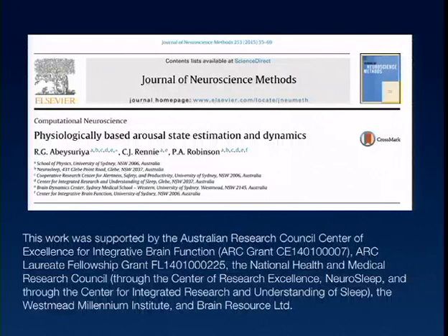And so our development is being able to stabilize that by imposing constraints on how rapidly the brain state can change. And of course, the ideas of mapping, of understanding where seizures are and where healthy states are in this sort of framework have been well established over the last decade. But in terms of the clinical application, you can't really use it unless you're capable of tracking those brain states.